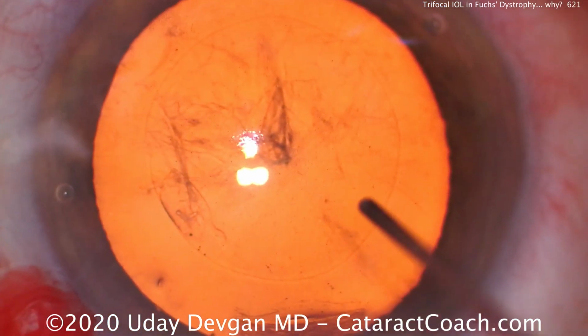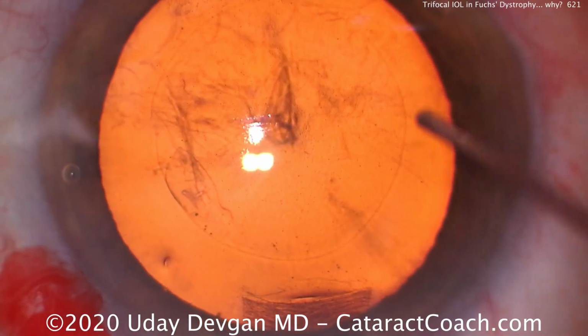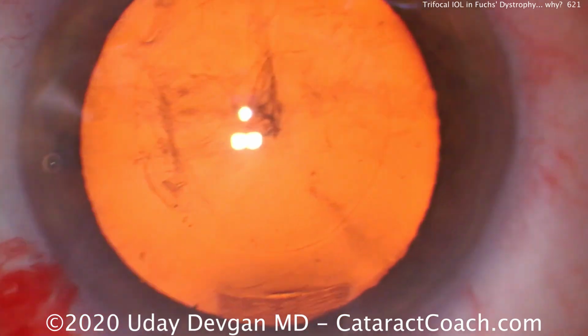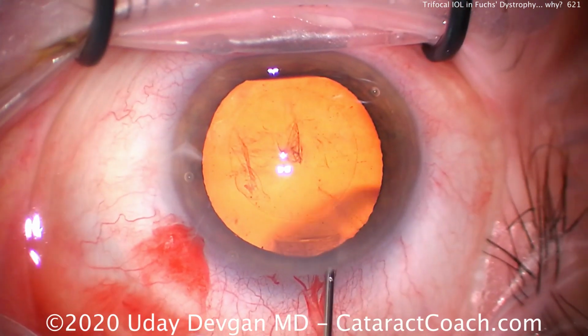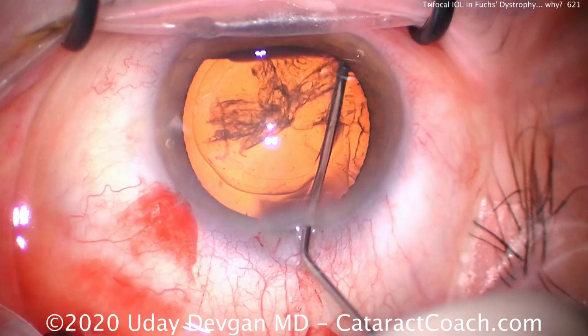Now, fortunately, the endothelial cell count's pretty good at 1,600 cells per square millimeter. Certainly it's low, but it's not terrible. And the patient has a central corneal pachymetry of 584 microns. And importantly, the patient's asymptomatic. She does not have the characteristic morning blurriness that takes a couple hours to resolve.